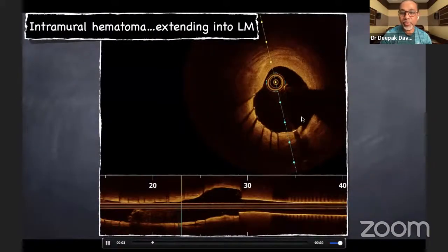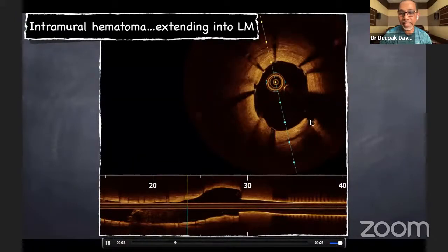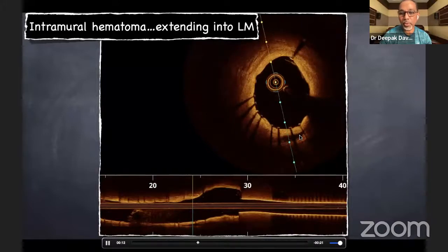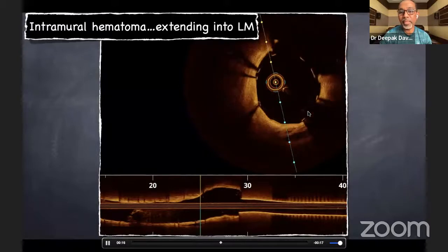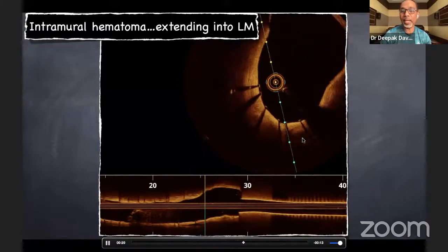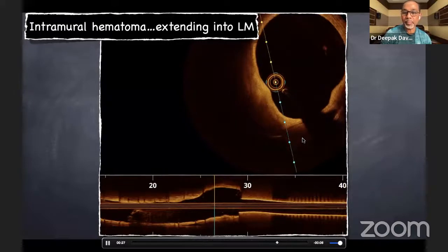You could see here, if you follow the cross section inside the stented segment, that there is a dissection there. There is an intramural hematoma, that's the intramural hematoma at the 5 o'clock position. That's again the LAD. It is seeping back into the left main. You could see that circumflex ostium. So this has come into the left main, hardly 2 or 3 millimeters back into the left main. You can see that particular image once again as it runs.